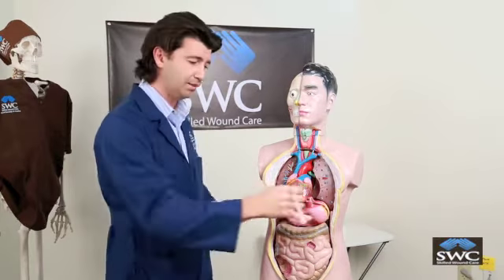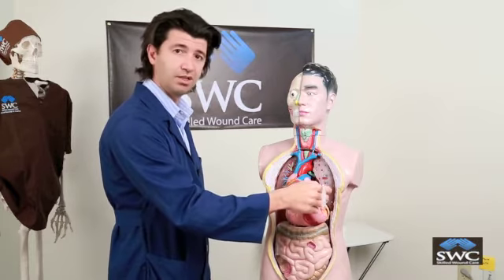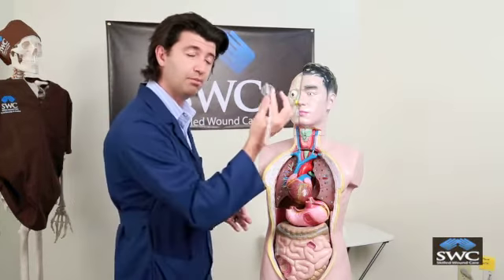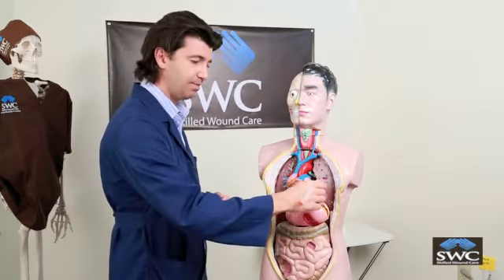The other thing that nurses should always be aware of is to make sure that the gastrostomy tube with its button are tightly fitting against the stomach and the skin, making sure that the tube is not going back and forth. Now, we have seen on plenty of occasions nurses have replaced a balloon gastrostomy tube with a button with a Foley catheter. The Foley catheter does not have the button here that holds the tube in place. And what does that cause? It causes a back and forth going in and out of the stomach, which can cause multiple problems.